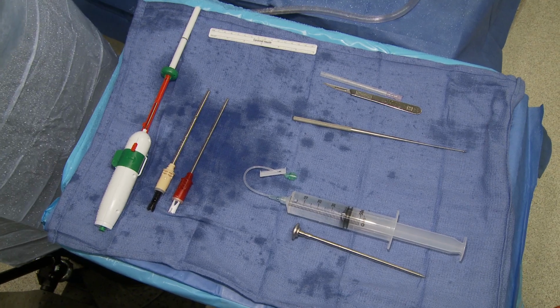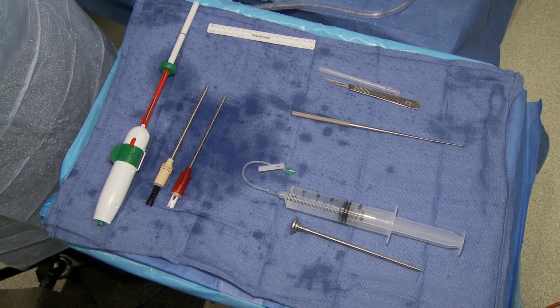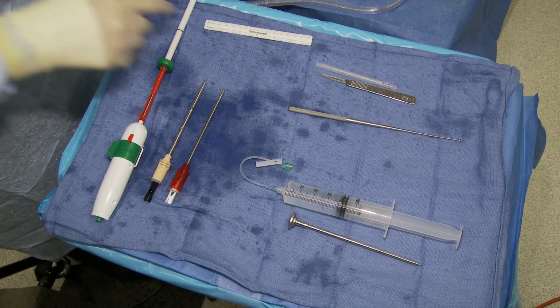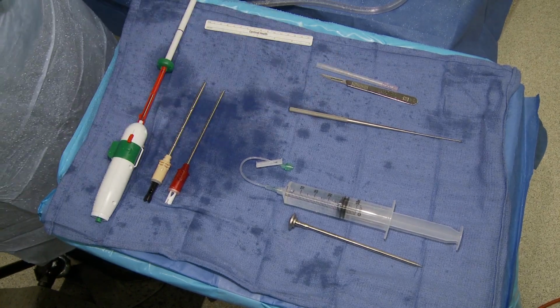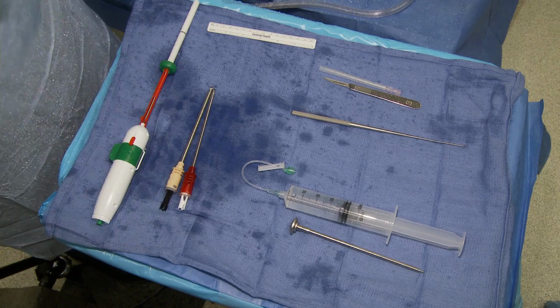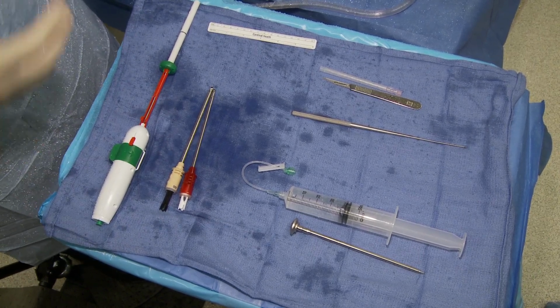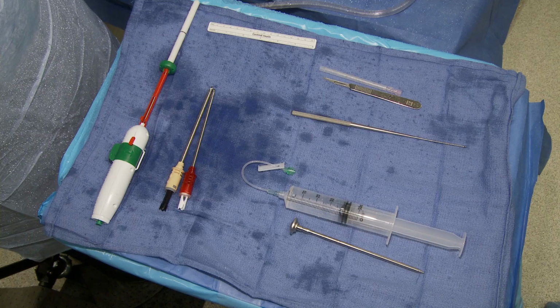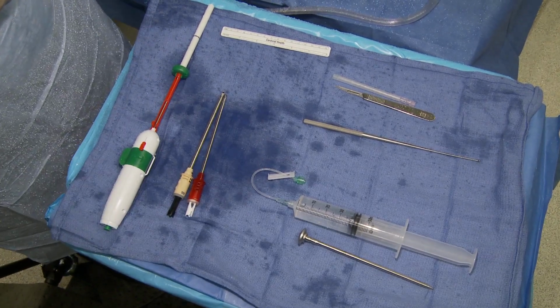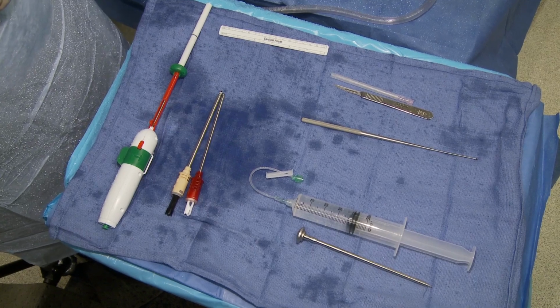So this is what our back table looks like. You can see that there's really minimal instrumentation that's required. You need the basic instrumentation that you would use for any arthroscopic case, which includes an 11-blade knife and a spinal needle. You can use a variety of different shavers or bone resection tools if an acromioplasty is to be considered. But basically, there is no specialized instrumentation that's required. Here we have the implant, the syringe that holds the saline for implantation, but that's about it in terms of the actual equipment that's necessary.